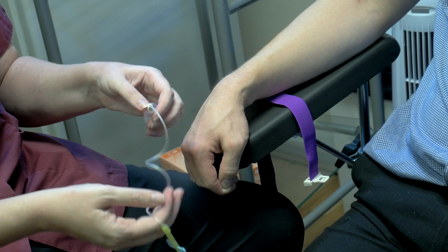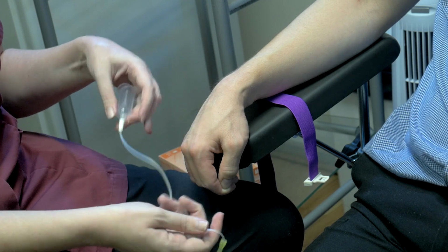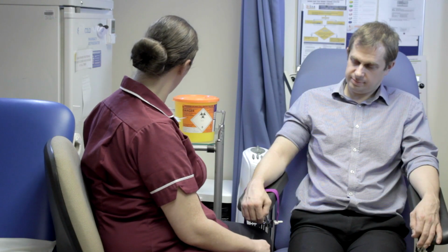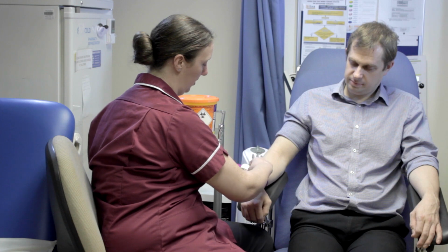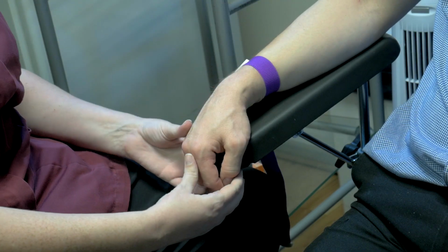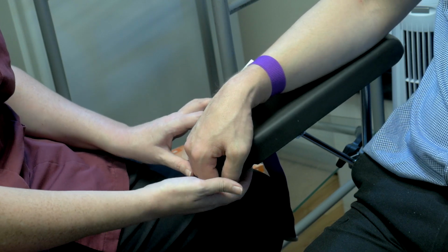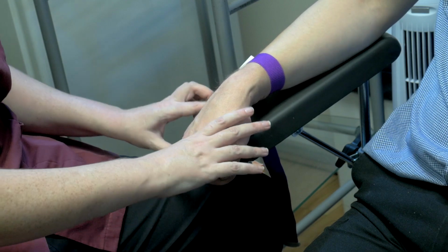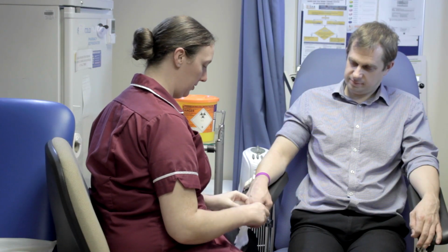Because it's an infusion set, these sometimes come off, so I always recommend that you give it a good push to make sure it's on. This is now safe, so we can pop it down and pop our tourniquet back on. We want to pull our tourniquet quite tight at this point, and a nice loose fist facing slightly downwards. There we go, you're fine. This is the last chance you have to put your gloves on.